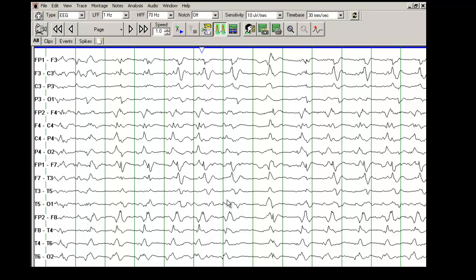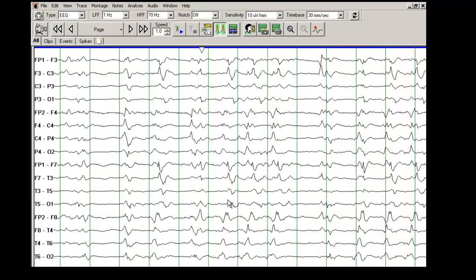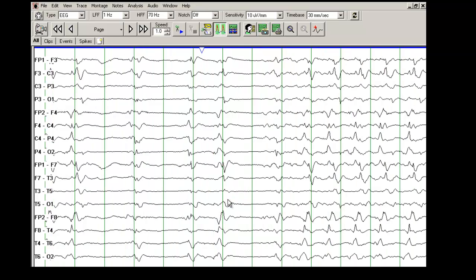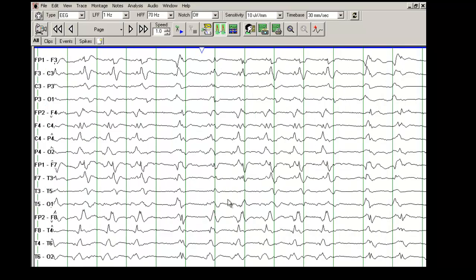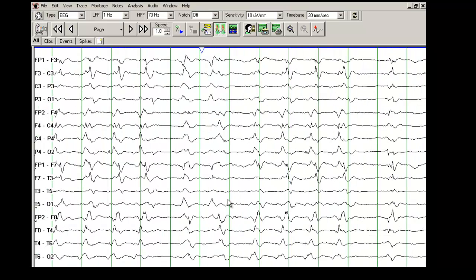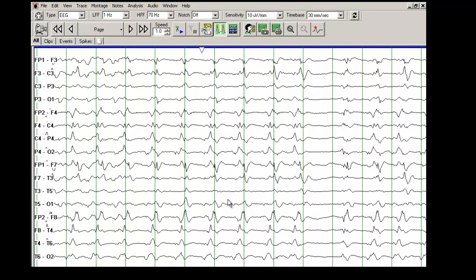Clinically, when the video was recorded, there were no changes clinically on this patient. And there was no clear evolution. The EEG pattern waxed and waned, but there was no clear evolution. So you can see these discharges on both hemispheres occurring independently.